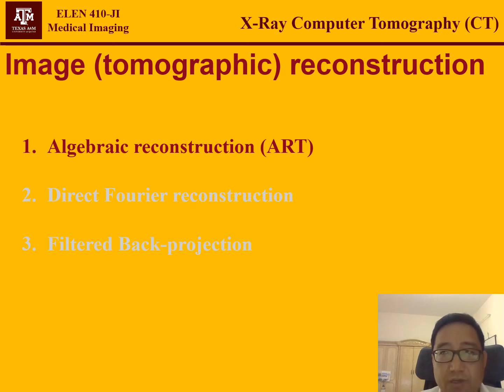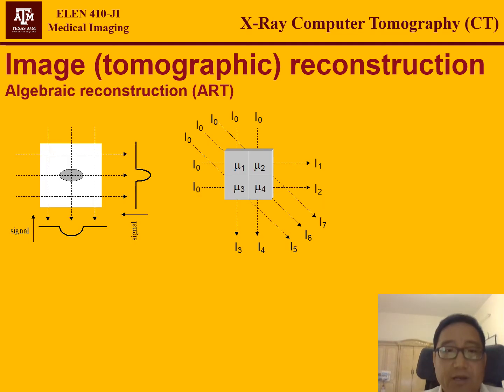Finally, there's a third method, which is called filtered back projection. It's actually quite easy to understand on the conceptual level. That is the method actually used mostly in the clinical scanner. So I'll just give a quick intro, and let's see, how do you do the algebraic reconstruction?